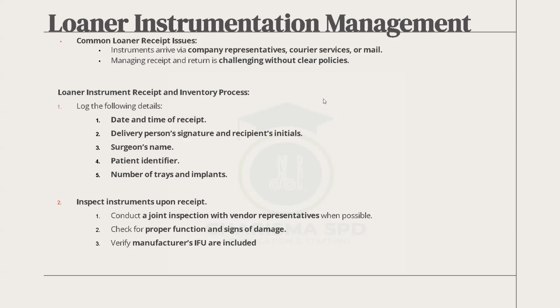And as usual, they expect that you will inspect the loaner that is coming in. When they drop it off, it has to be cleaned, washed, and soaked, it needs to flush those lumen pieces, and it needs to be put together and ready for you when the surgeon needs it. Okay, next slide.